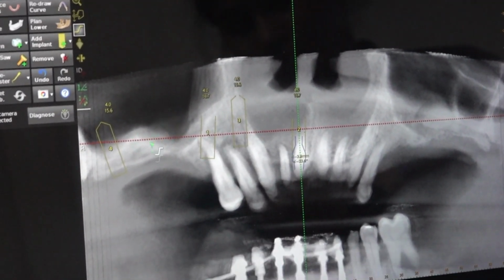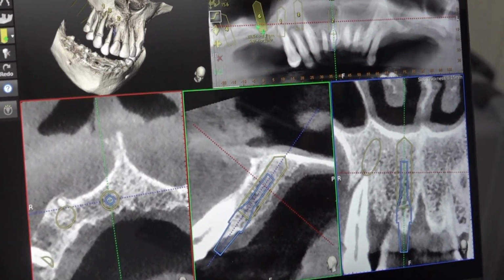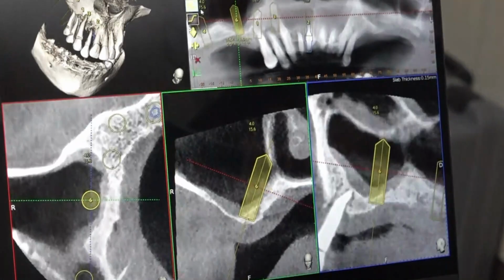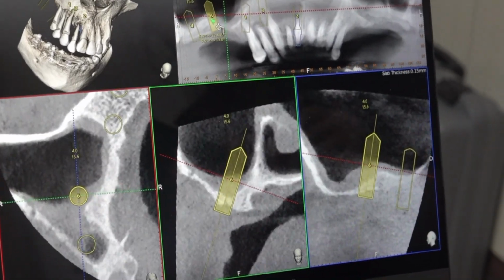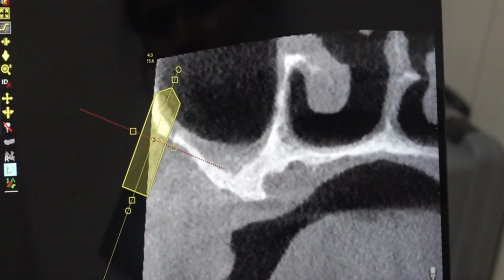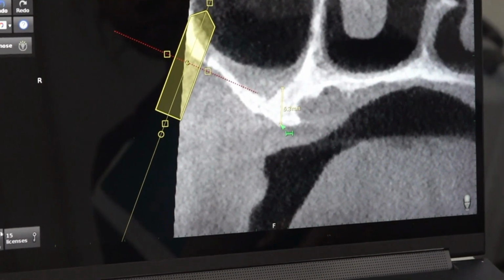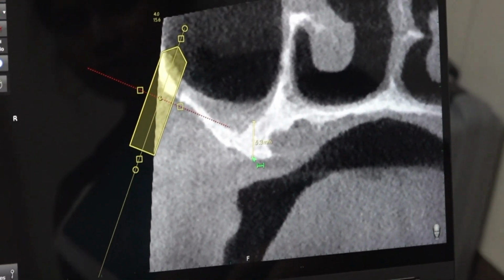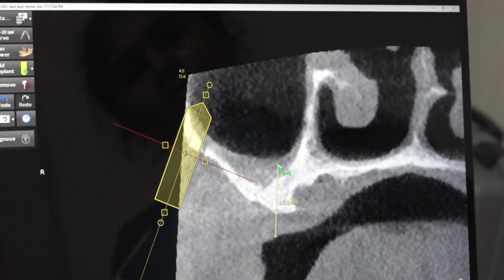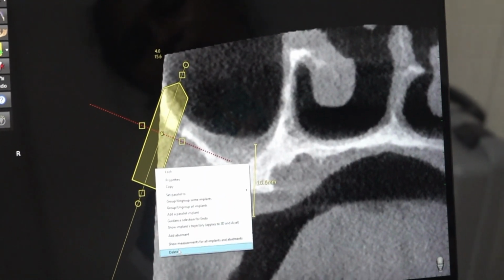Can you place an implant in this molar area? We don't know, we will check now. Okay, see there is no bone actually. Okay, we will go to the 7. Okay, very thin bone, maybe 5 mm bone is there. You can place a basal 3.6 by 10 or something like that. Okay, but not very good bone, very thin bone. Okay, we'll delete.